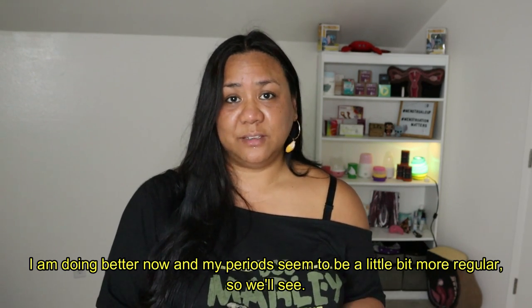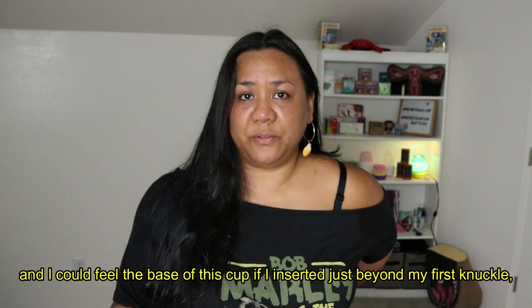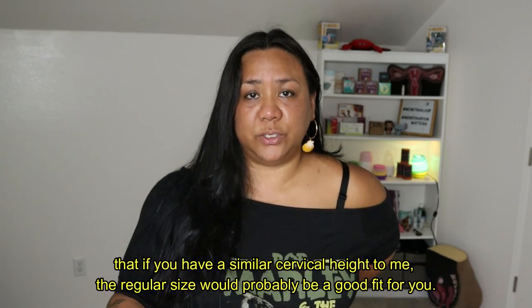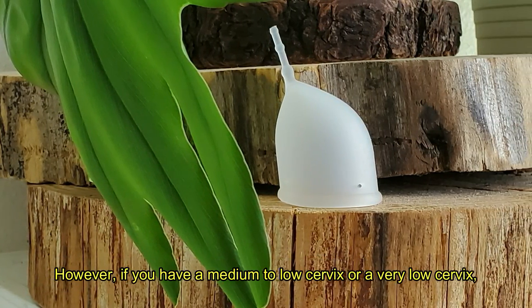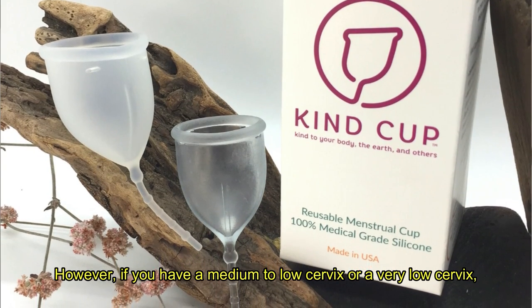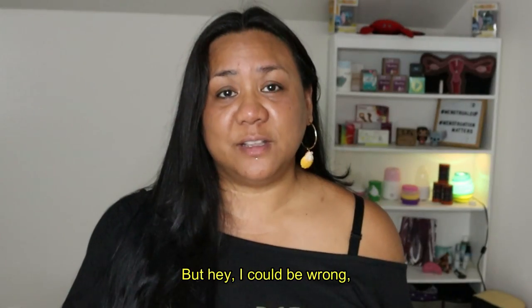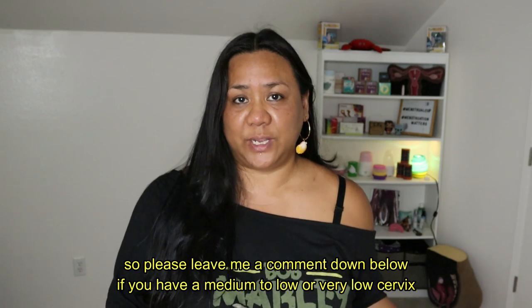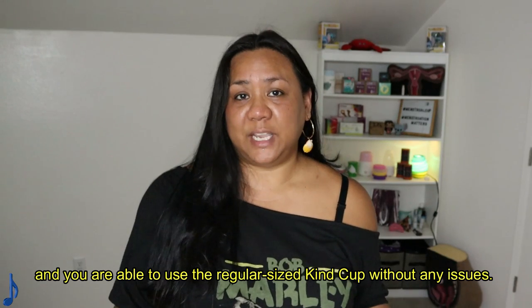I will say that since I normally have a medium-high cervix and I could feel the base of this cup just beyond my first knuckle, that if you have a similar cervical height to me, the regular size would probably be a good fit for you. However, if you have a medium to low cervix or a very low cervix, the smaller Kind Cup would probably be more comfortable. Please leave me a comment down below if you have a medium to low or very low cervix and you are able to use the regular size Kind Cup without any issues.